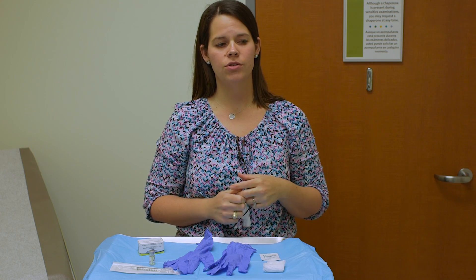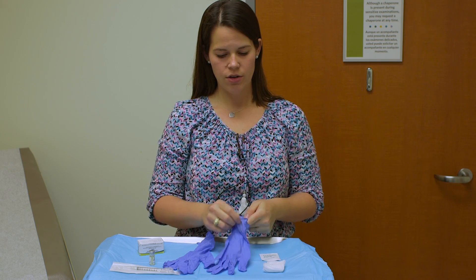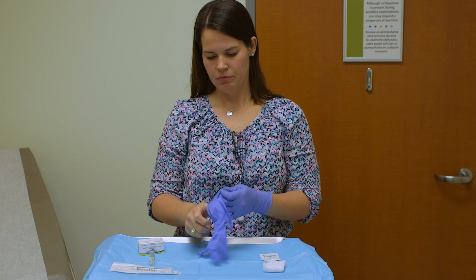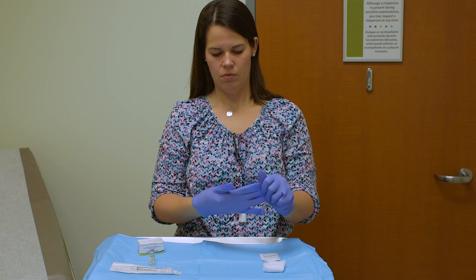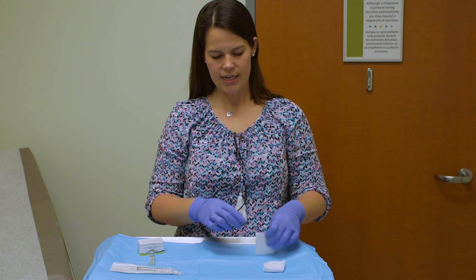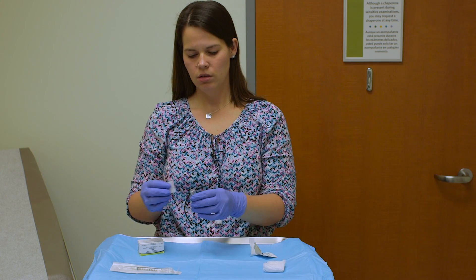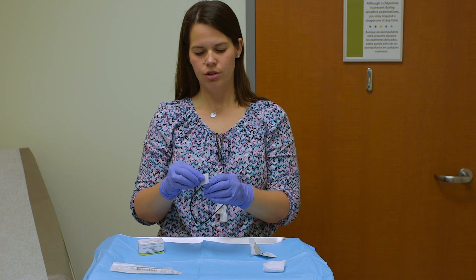The first thing you're going to want to do is make sure that your hands are cleaned. Once they are dry you can place your gloves on. Next, take an alcohol swab and clean the top of the vial. Make sure you do this in a circular motion.